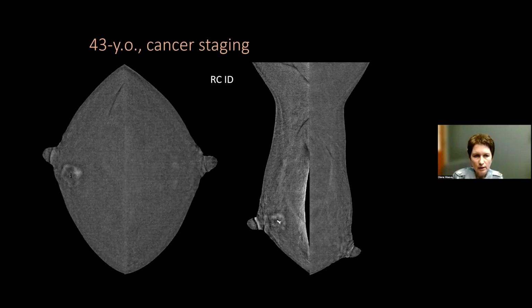And you see an example of an irregularly rim-enhancing mass in the right breast. So this is not by any means looking like an eclipse sign. It's very irregular, especially inside. So we don't have a nicely circumscribed dark spot. Instead, we have this very irregular looking enhancement.